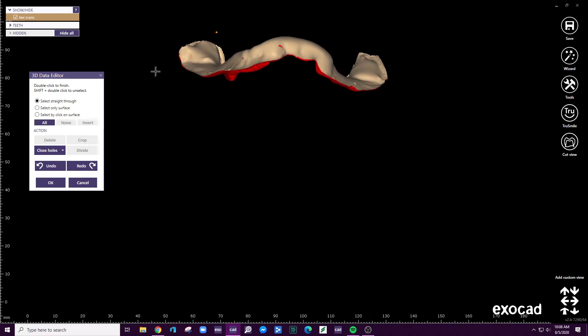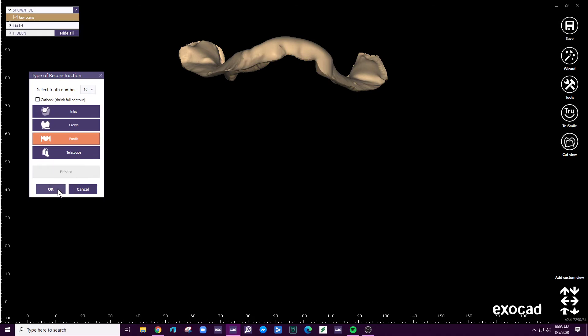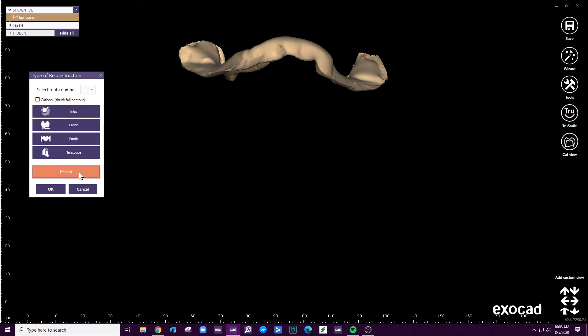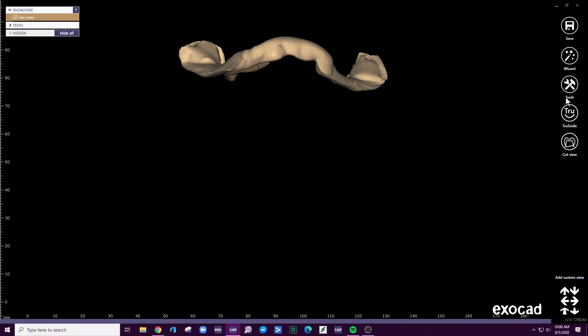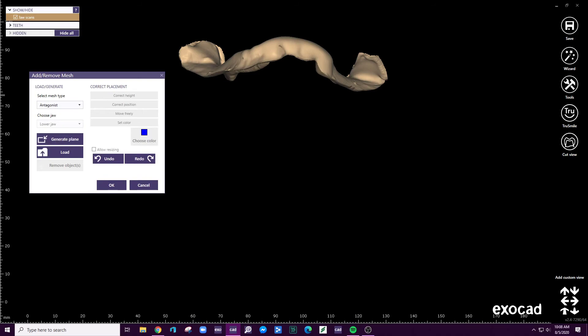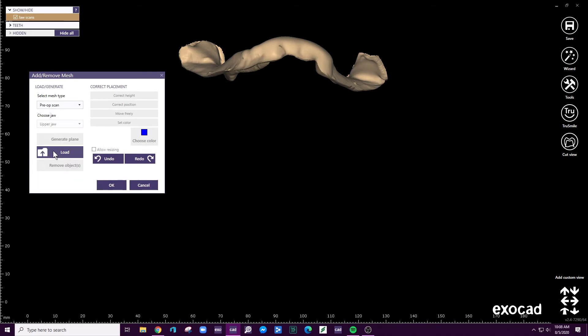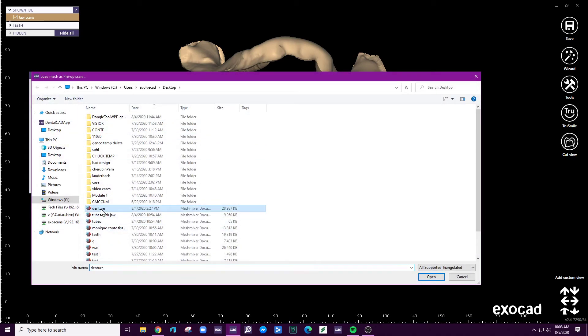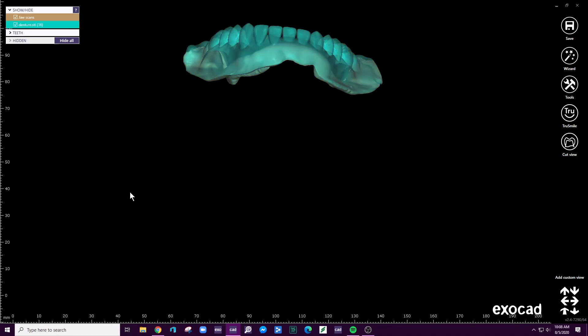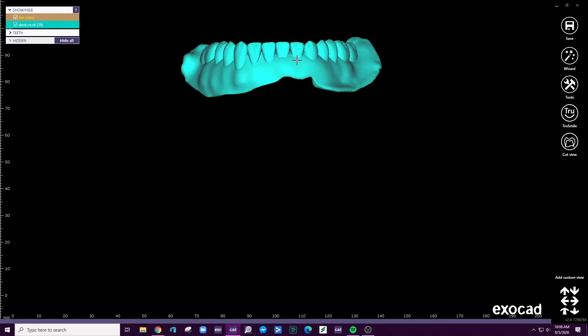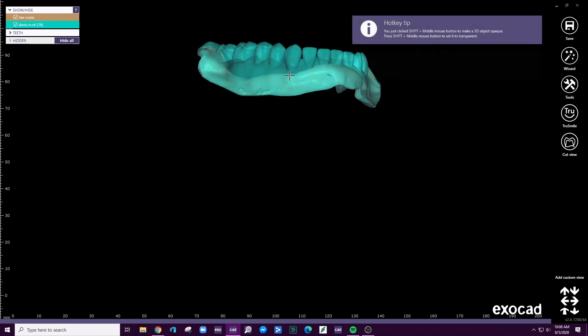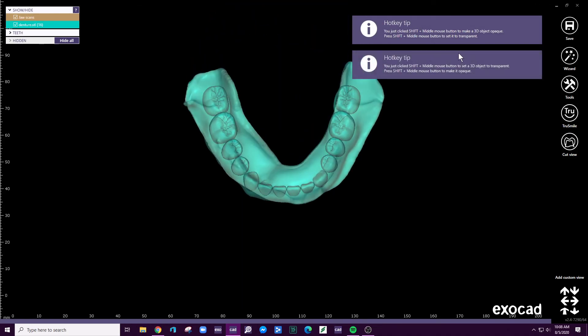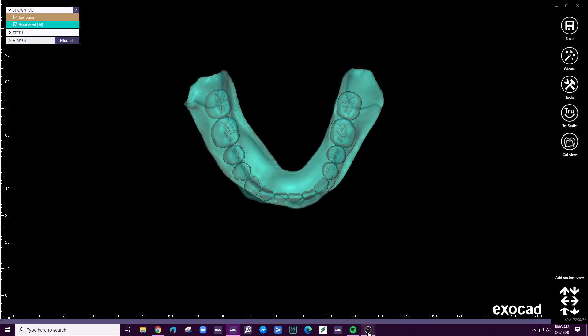So see, now I have the file there. And if I wanted to, I could just reload the same denture file. It's like a pre-op. And see, now we have the pre-op and the jaw scan in place. All right, there you go.